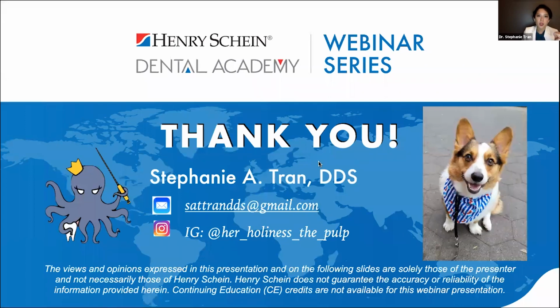The symptomatic release of pressure on a Tooth Slooth, if there's pain on release, can tell you if there is a larger fracture, because it's the pieces coming back together that are having pain. It's not definitive of a crack versus a fracture, but it tells you something. It tells you another piece of the puzzle. Additionally, what you're looking for is pain on specific areas, specific cusps, or a specific side, or both sides, like mesial and distal. So it can tell you if there's a fracture or a crack, but the pulpal involvement is separate. It doesn't tell you that there's pulpal involvement. These are separate things. All right.